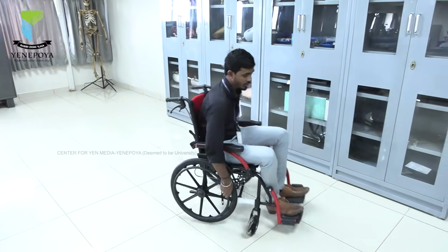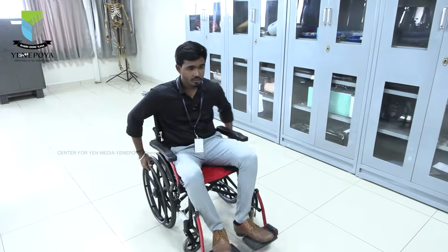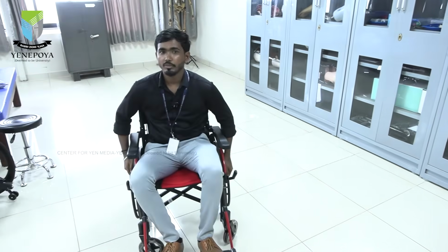Same goes to this way. So it's like a front pull and back, front pull and back, and front pull and back. Why this sideways maneuver is very important is that this person has to use this wheelchair at home also, so they cannot shift the other objects which are already there. So they have to adjust themselves and they have to move. That's why this sideways maneuver is very important.